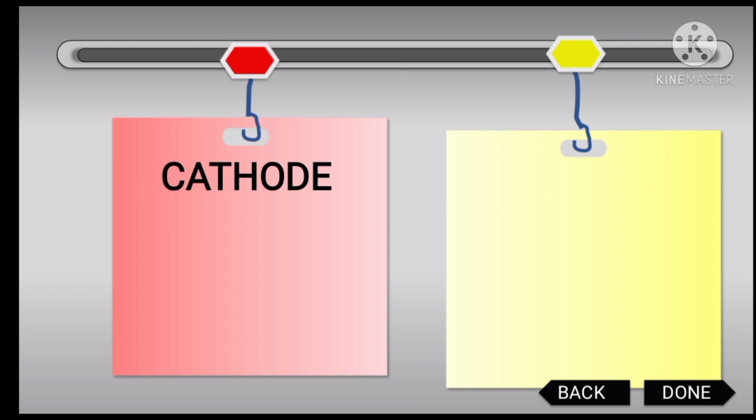The cathode, a negatively charged electrode. The cathode has two types. First is what we call the Crookes tube. Historically, X-rays were discovered radiating from experimental discharge tubes called Crookes tubes, invented by William Crookes and others. Commonly known as Crookes tubes, they were used until 1920.